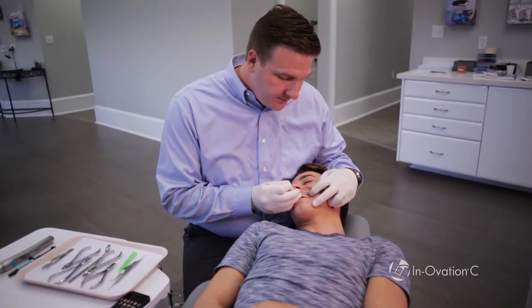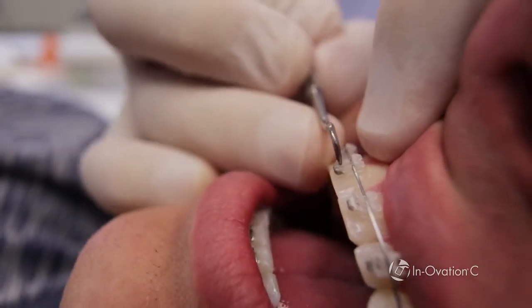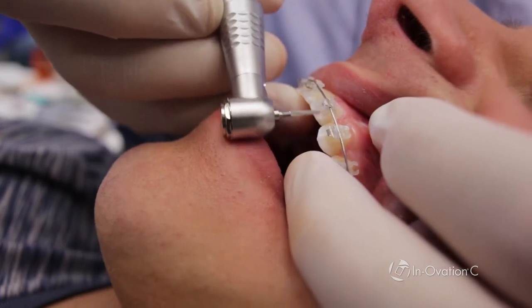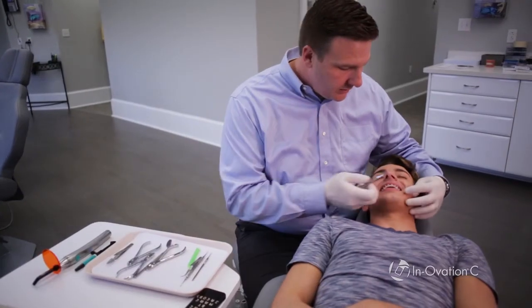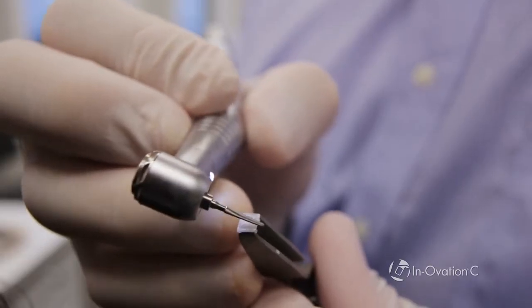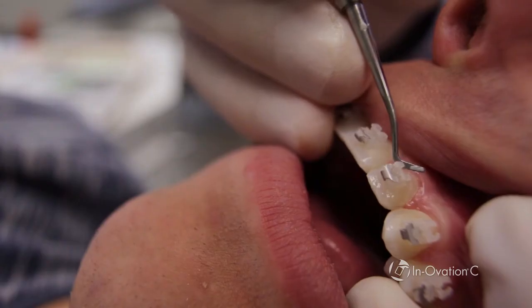The process of repositioning the bracket is very simple with a simple opening of the doors. From there, the flash from the incisal and gingival of the bracket is taken off with an adhesive burr. A ligature cutter is used incisally and gingivally to squeeze the bracket, and the bracket comes right off. It's really simple — all you do is smooth off with the same adhesive burr on the back of the bracket and you enter into your normal rebonding process.